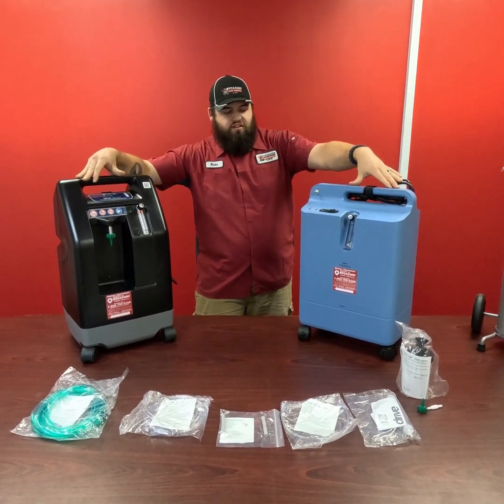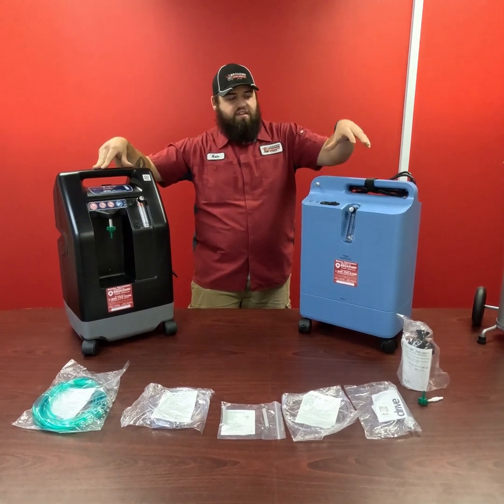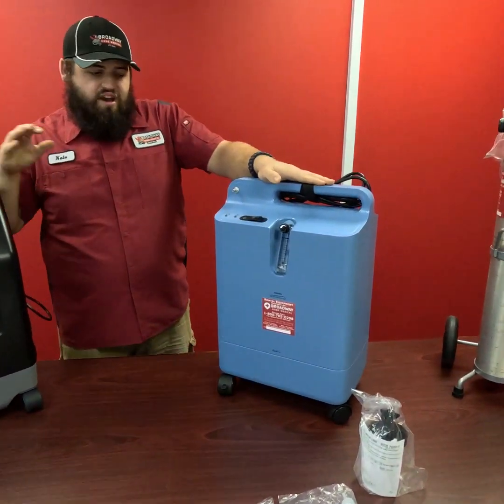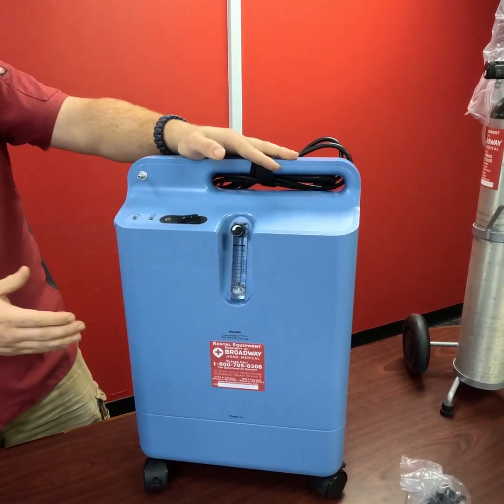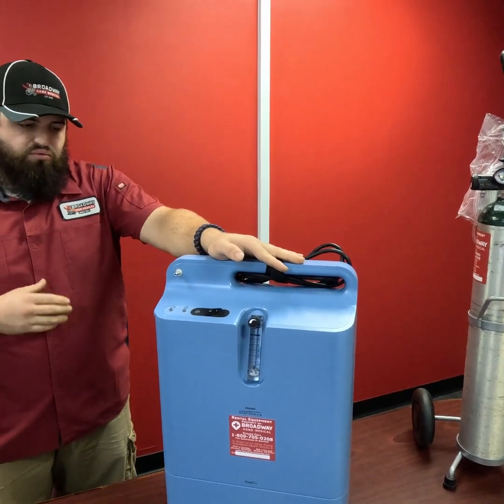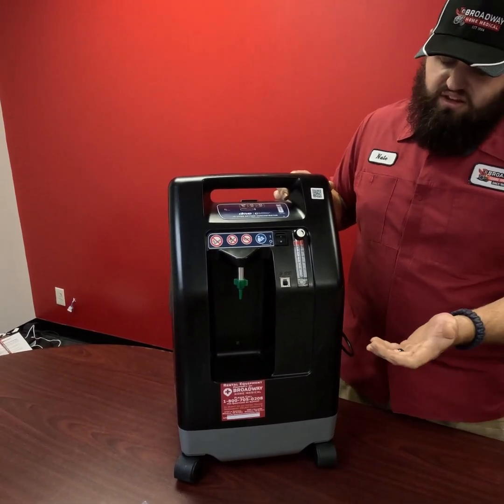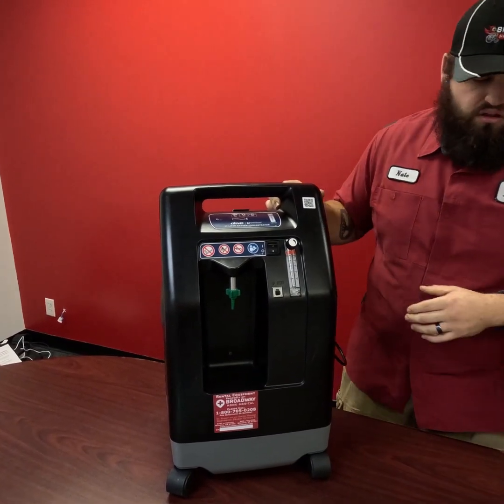So today I have here a Respironics Everflow and a Drive DeVilbiss. This is a 5-liter machine, and this is a 10-liter machine. Now the Respironics Everflow just comes in a 5-liter oxygen machine. Respironics does have a 10-liter machine, but typically we like to use Drive's 10-liter oxygen machines. Drive also has a 5-liter option as well.